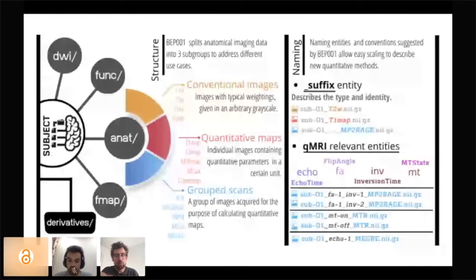But everything in between is somewhere in between. So it's neither T2 star, nor PD. And the reason that you do all these echoes is ultimately because you want to fit a model. You probably want to fit an exponential curve to it.